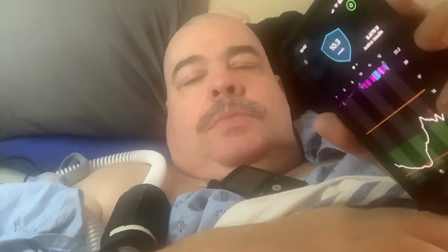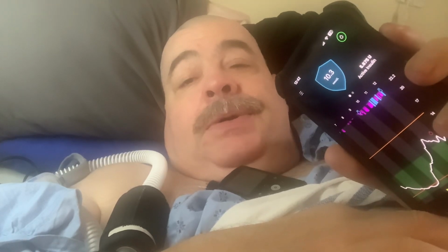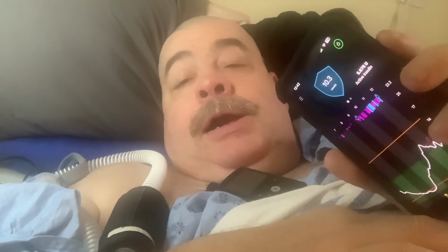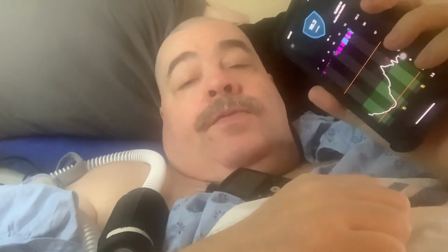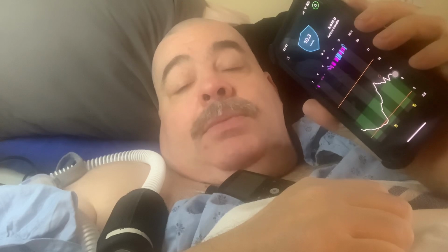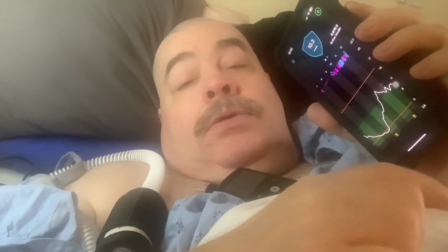Let's take a look on our phone here and let's see what's been happening. Current blood sugar is at 10.3. It has been up. 10's my new magic number, I guess. I went up over 11 and I've come down a bit. And hopefully we'll go down lower.